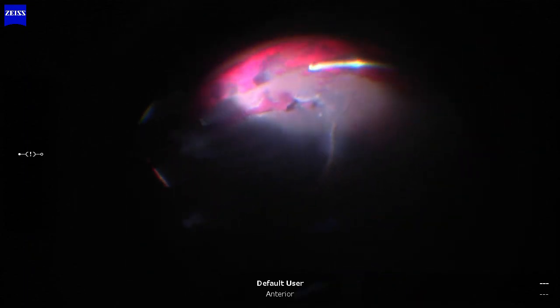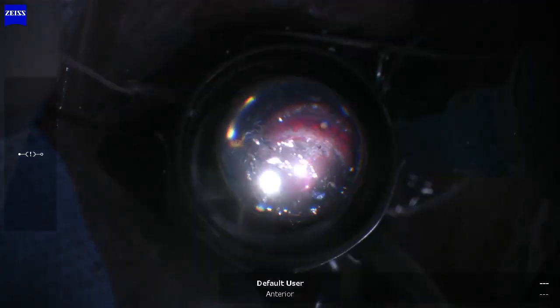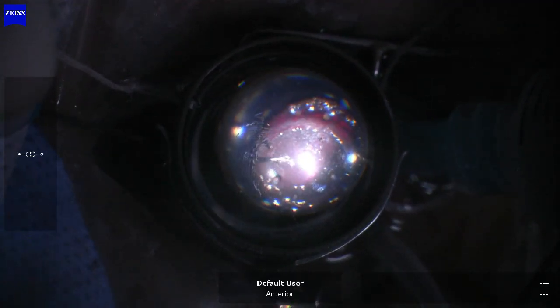Peripheral shave vitrectomy is completed. Nasal retinotomy is created using diathermy followed by air fluid exchange. Endolaser is done. Extent of endolaser depends on the underlying pathology. The choice of vitreous tamponade is as per surgeon's discretion.